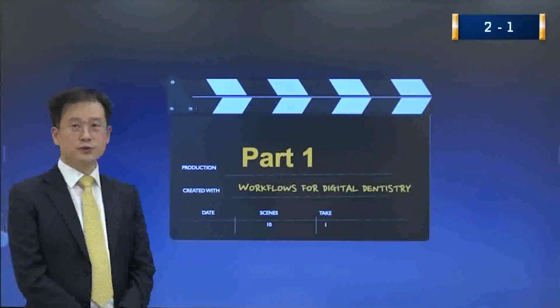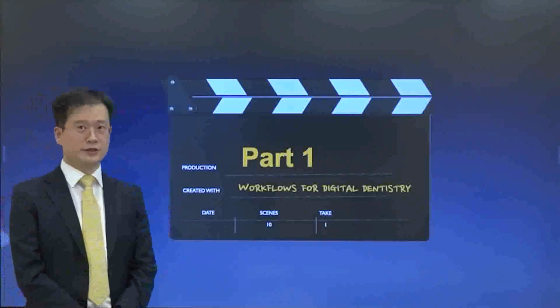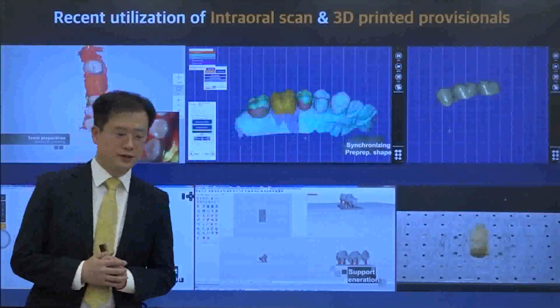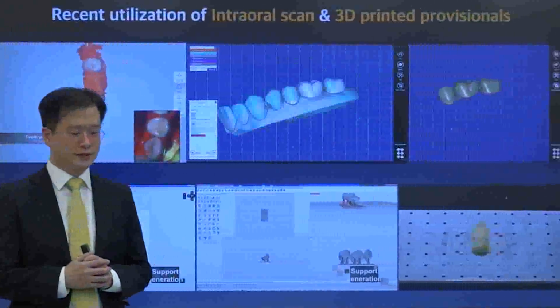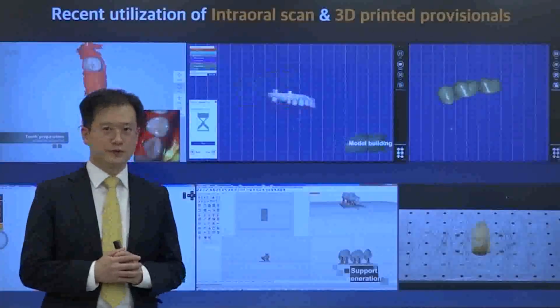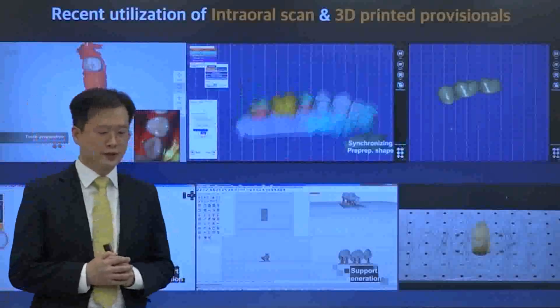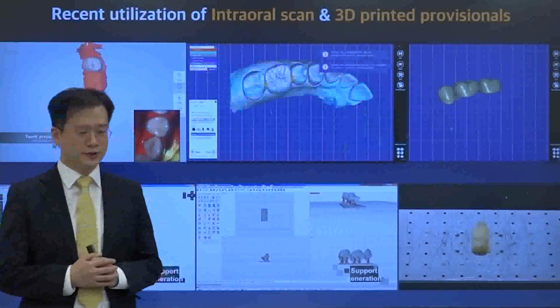I'd like to show you how I utilize digital devices in my clinic first. As most of you do in your clinic on a daily basis, so do I. Scanning, 3D printing for provisionals. When you acquire intraoral scan data before and after tooth preparation, you can quickly and easily design provisional teeth.